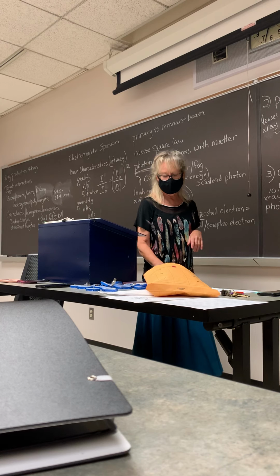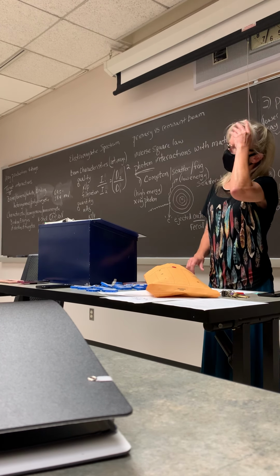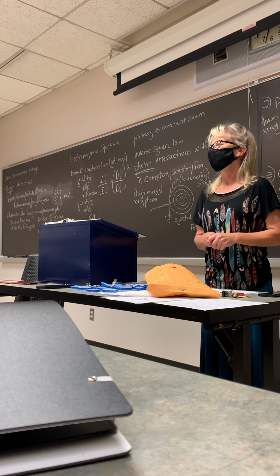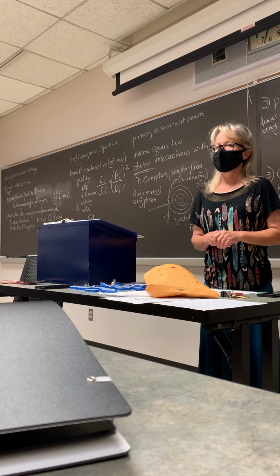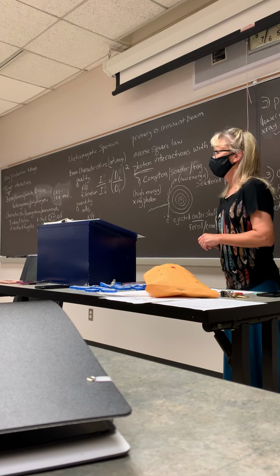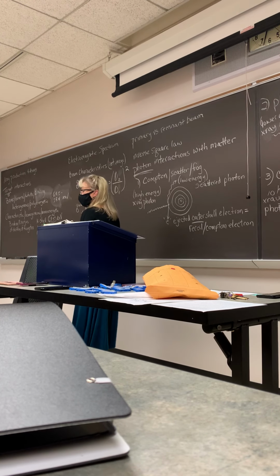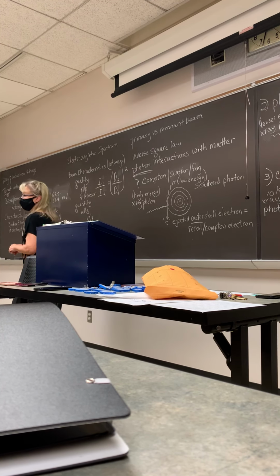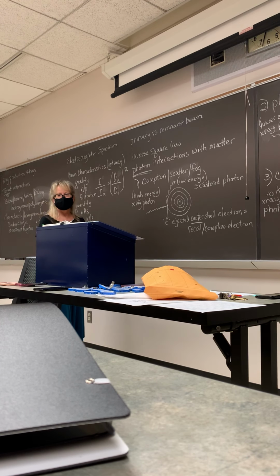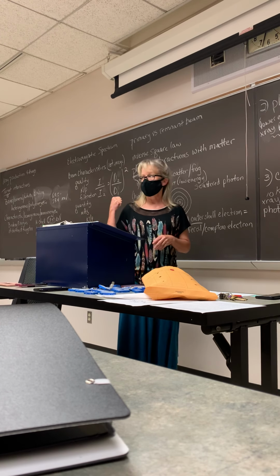When do we get brems interactions? You get brems at any kVp you set. Usually the tubes go up to 150. So from 1 to 150 kVp, you can get a brems.